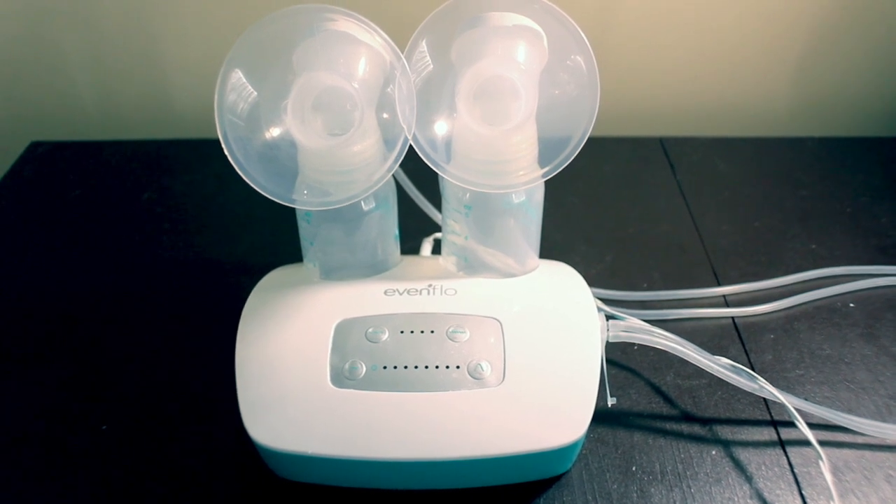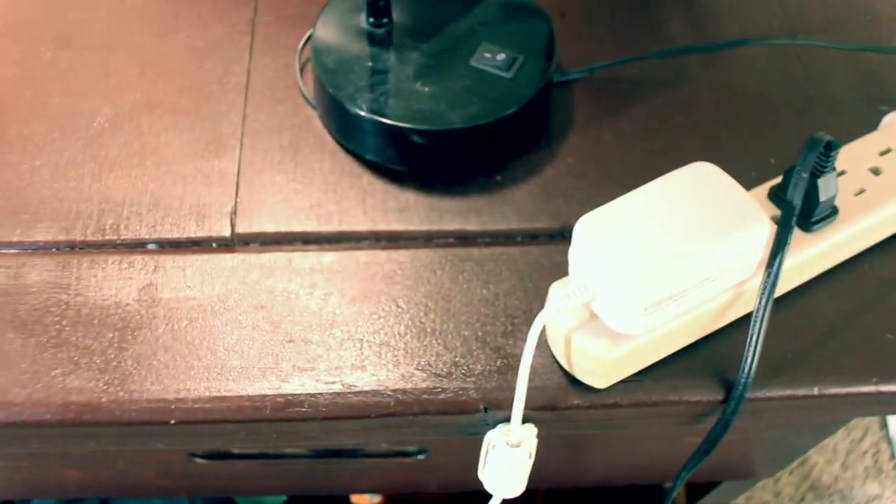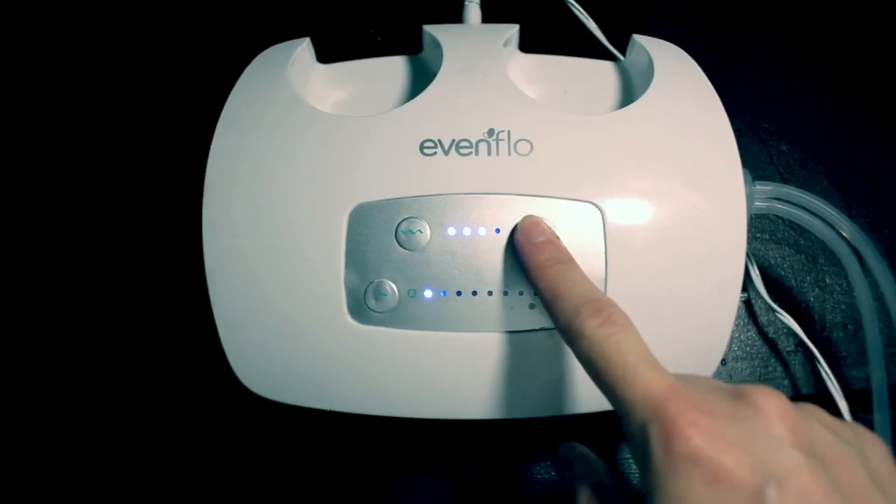I use the Evenflo pump, and it's pretty much the cheapest one you can find. It has a very nice long cord so you can be at literally one end of the bed and plug it in on the other side and stretch it across. As new moms, we kind of need to be able to go here and there and be wherever.